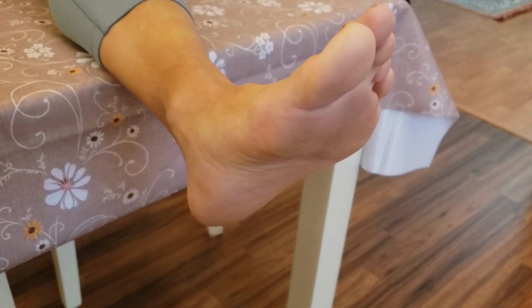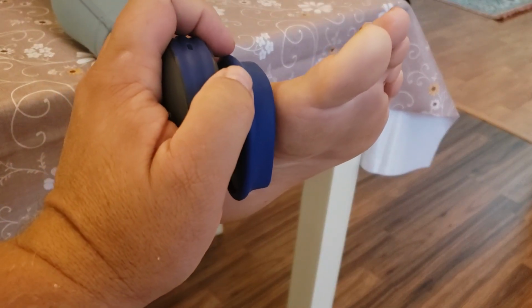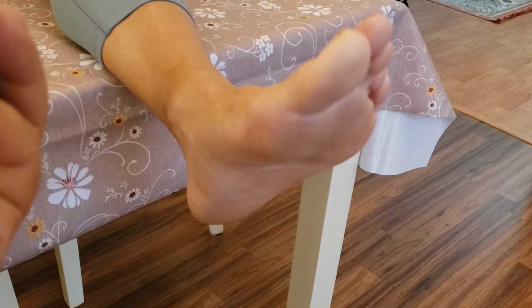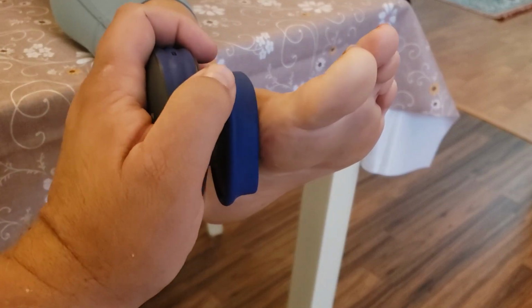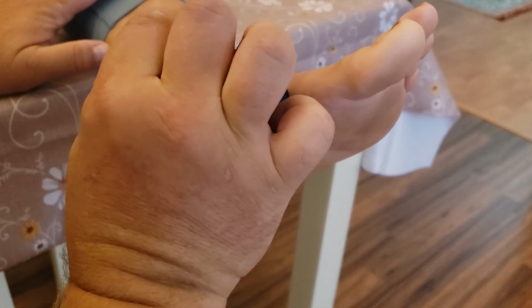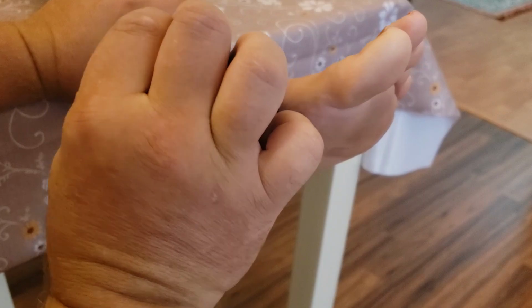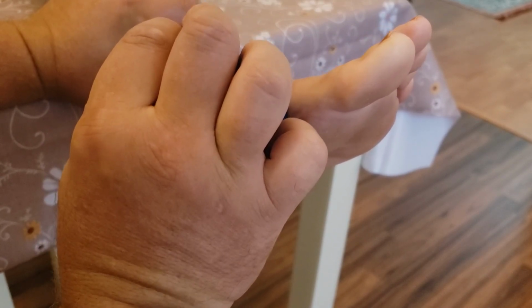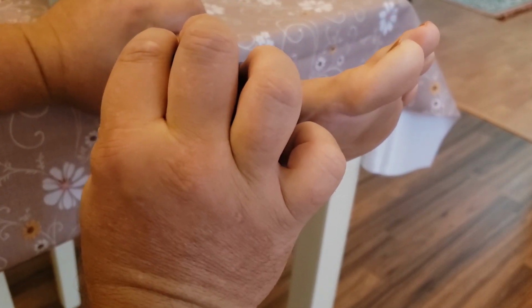So where do I place the dynamometer? I'm going to place the dynamometer right here on her metatarsal. You can't see this in video, but my elbow is going to be pinned to my side, and I want to be an immovable wall. I'm going to have my hand here on the metatarsal and my hand on the dynamometer. I'm going to stabilize her right here, and she's going to push that toward me. I'm going to tell her to push for about 5 seconds. I want to make sure I'm not moving. If I push back and we have this little tug of war going on, we're going to get some bad readings.